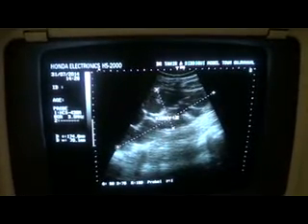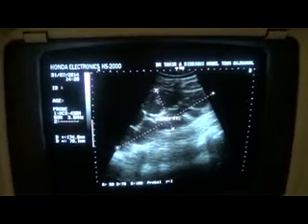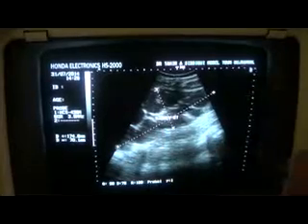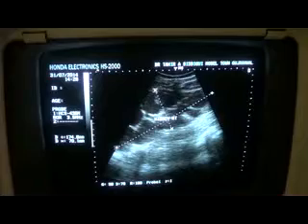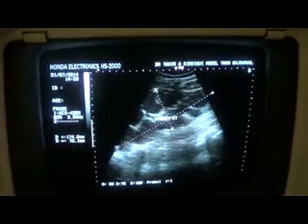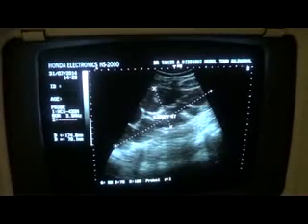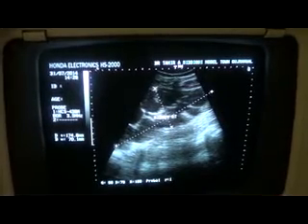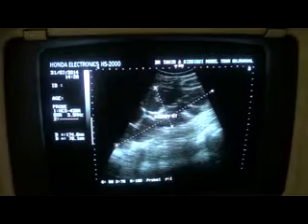pathological, is not considered to be normal, at least if not pathological. However, the length may vary with the height of the patient, but the anteroposterior diameter should always remain the same, that is the 5 centimeter. Now here we see 7, so the kidney is enlarged both in length and in anteroposterior diameter. This is the first parameter that should have been noted first.